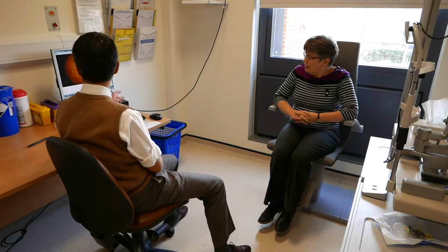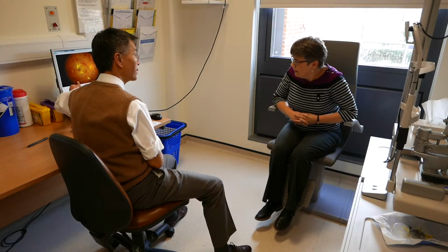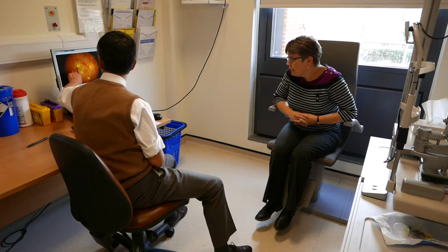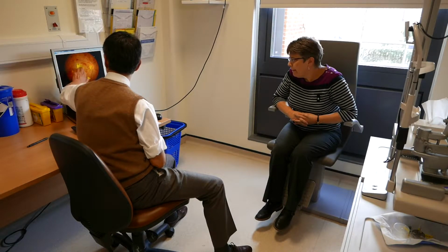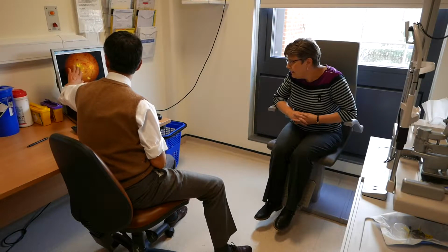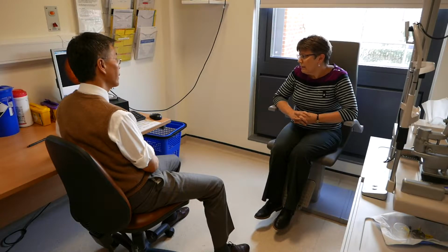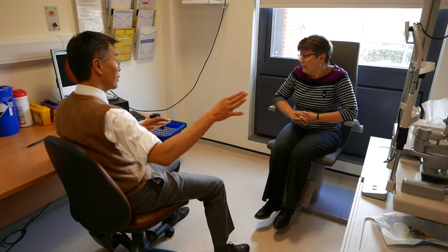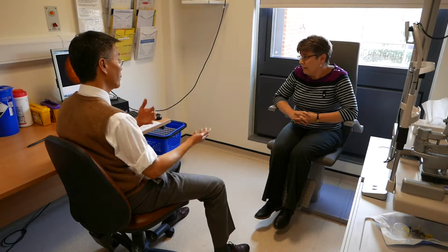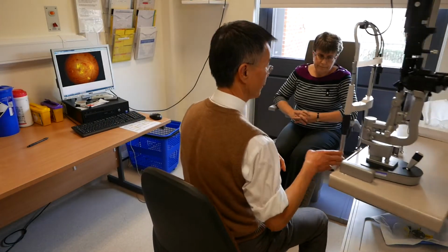So this is a picture that has been taken of your right eye. I don't know whether you can see, but you do have quite a lot of bleeding. This is a picture of your retina, which is where the disease occurs, and this is the most important part of the eye. You can possibly just see these little yellow spots. Yes, I can. These all indicate that you have fluid leaking in that part of the eye. Now this needs treatment, otherwise it will affect your vision. So if I may, I'm just going to firstly have a look at you on the machine, and then we'll talk a little bit more about what treatment is required. Okay, that's fine.